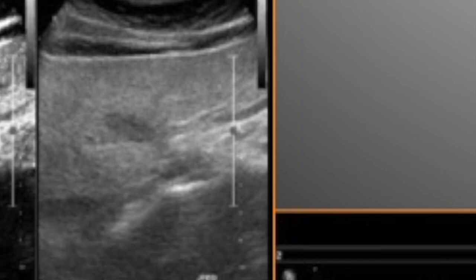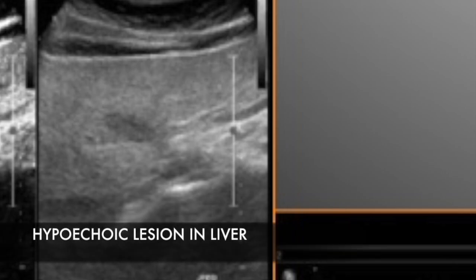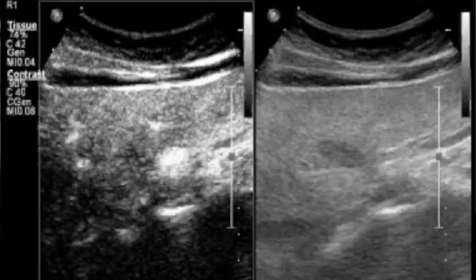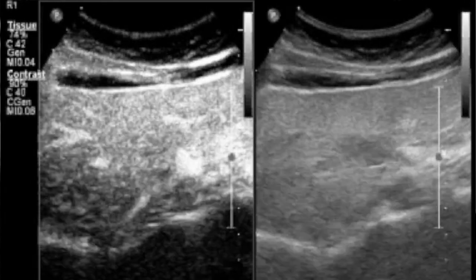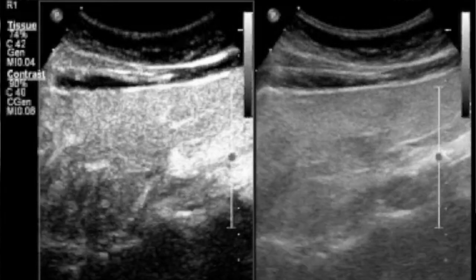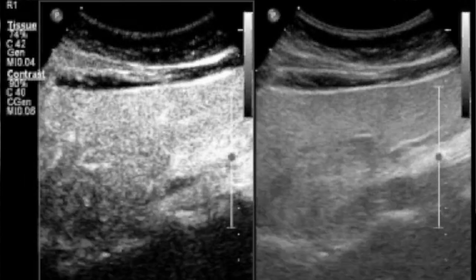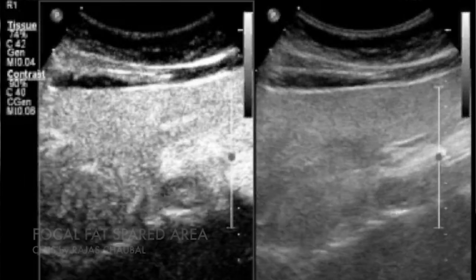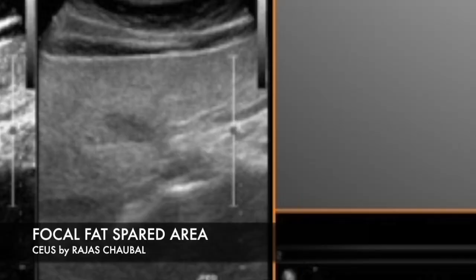This was an elderly gentleman who came to us with a hypoechoic lesion in the liver. When we performed contrast ultrasound we saw that this was actually iso-enhancing to the rest of the liver parenchyma, so this was only a fat-spared area.